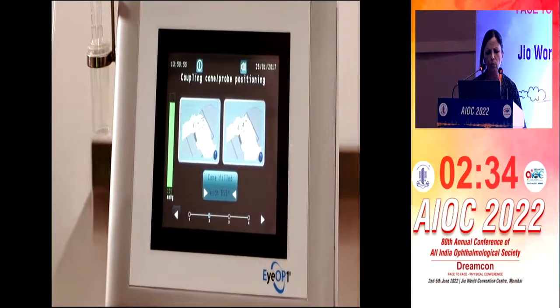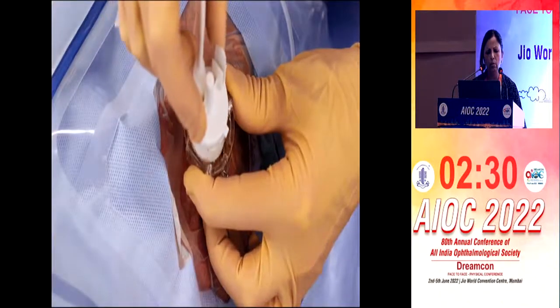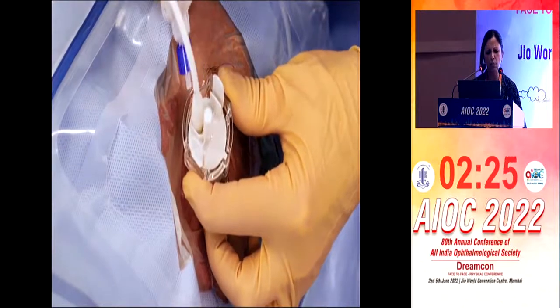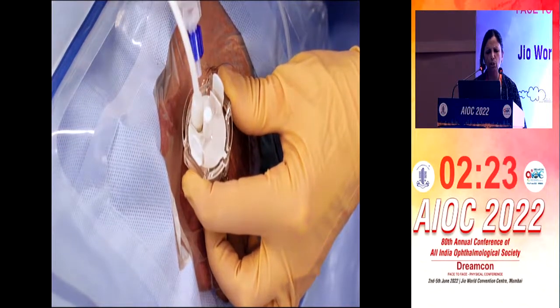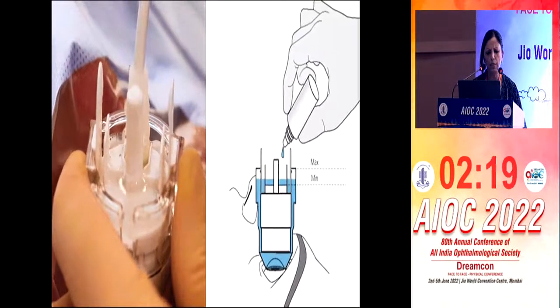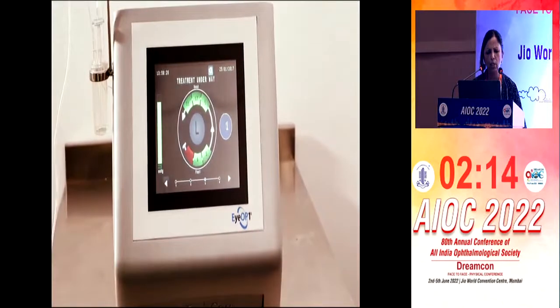Then this internal docking system can be turned according to the horizontal meridian in which you are applying the ultrasound. And that's the maximum fluid that you can give.